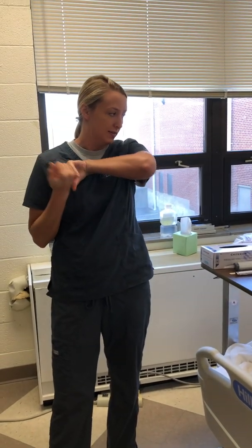I'm doing my insertion of NG tube video, and before going in to start it, I would make sure they haven't had any previous nasal surgery, deviated septum, gag reflex. I would check their nares, and then I'd make sure I have an order, and then I would begin.